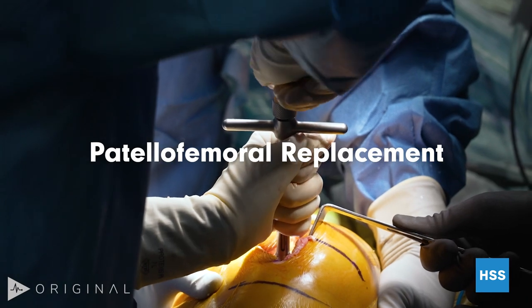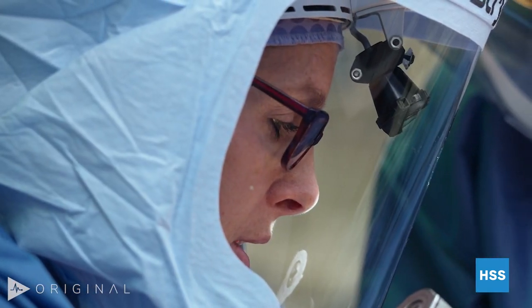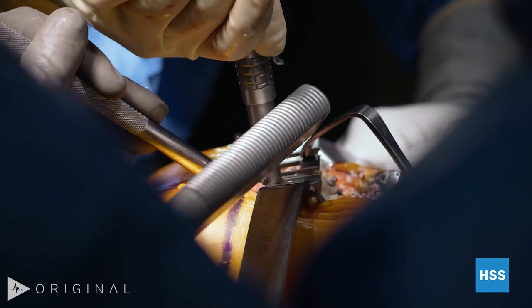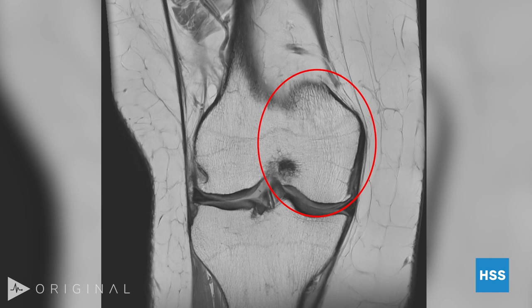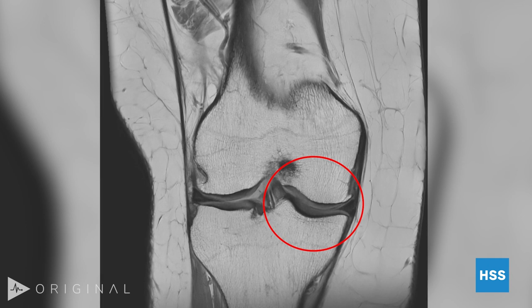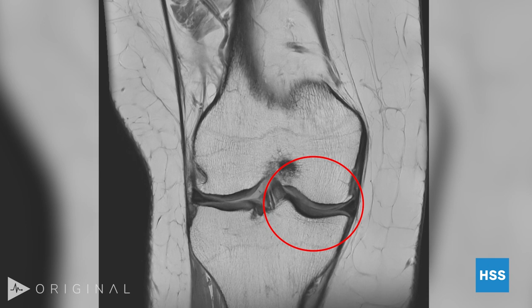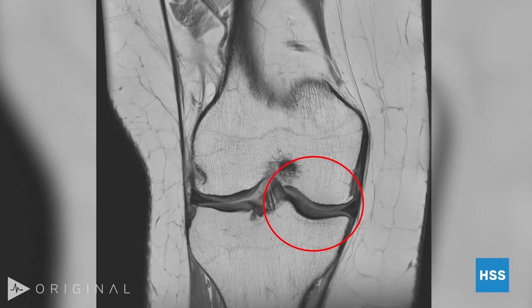This is a unique type of partial knee replacement. When we think of partial knee replacements, the knee is like a three-room house. There is a medial, or inside, component — this is the distal femur, this is the tibia. This compartment has bone on the top and bottom, good cartilage — this gray material — as well as a nice meniscus. So this one-third of the knee looks very healthy.